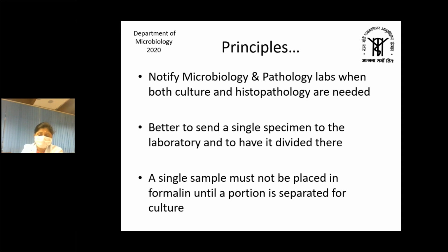Many times the new residents who join are not aware of this fact, and they have to be told and guided that coordination between the microbiology as well as the pathology labs has to be done, because if you put all of the sample in formalin, then the organisms will die out and we will not be able to process it for culture. So better is to send a single sample first to the microbiology laboratory and then have it divided there.